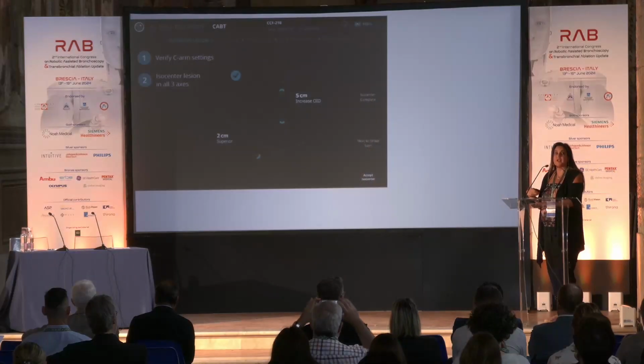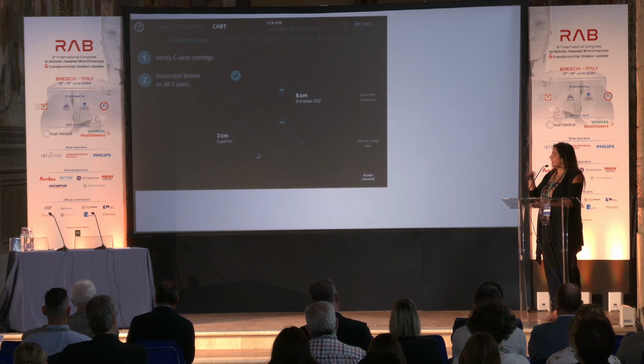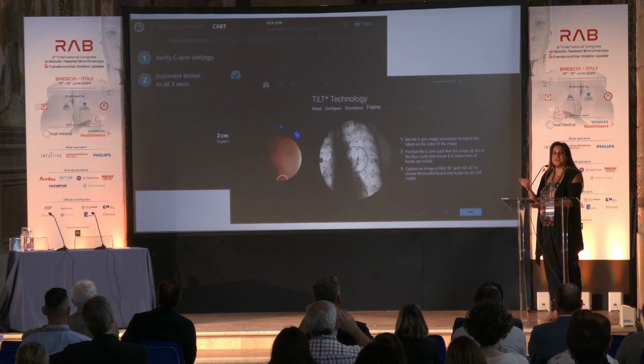And that's how you know that you're isocentering around the nodule so that your imaging is really great. There are technologies out there that actually tell you exactly where that nodule is. So you guys all saw Body Vision cases yesterday. After you do your spin, it tells you exactly the height of the bed, where that nodule is, how to fix your fluoroscopy machine.